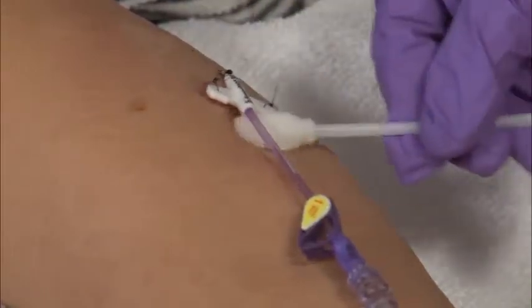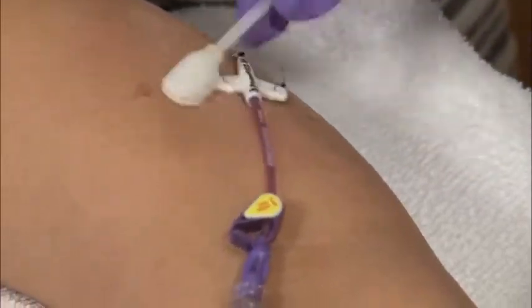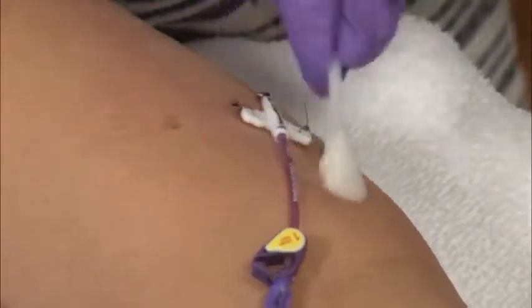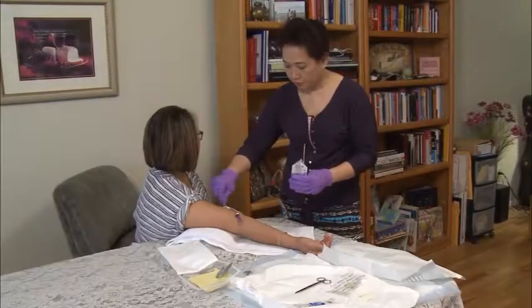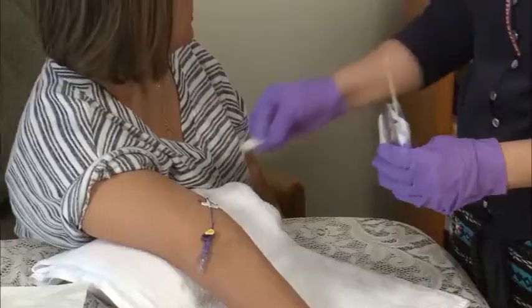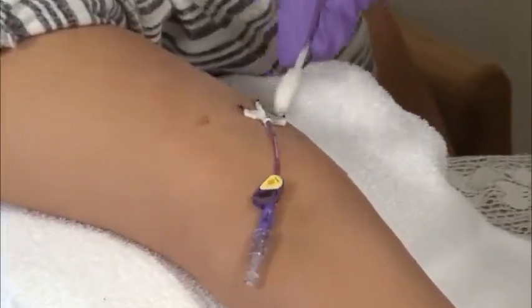Move outward to include the hub and the stitched wings, and then continue scrubbing in a back and forth motion outward in widening circles. Be sure to clean all the skin and catheter that lies under the dressing. Discard the swab when an area of 3 to 4 inches from either side of the insertion site has been cleaned. Repeat using all 3 swabs.